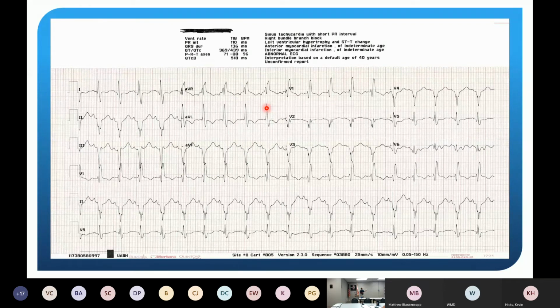So I look at V1, I got a big R wave. I look at AVR, okay? A little bit of a Q, not much there, but so this is a right bundle. So with the right bundle we talked about, you should see ST depression in V1 through V4 of some sort, and we don't see it. So this right bundle makes me concerned for a STEMI because we're pretty upright V1 through V4 with no ST depression where it should be down. Okay, so this is very concerning for somebody who has a right bundle branch block having a posterior event or a septal anterior event.